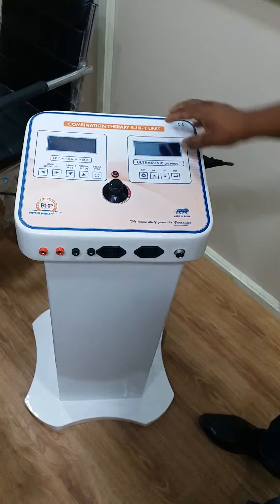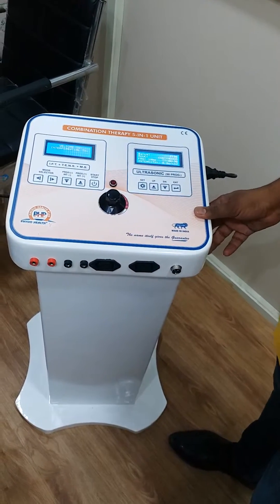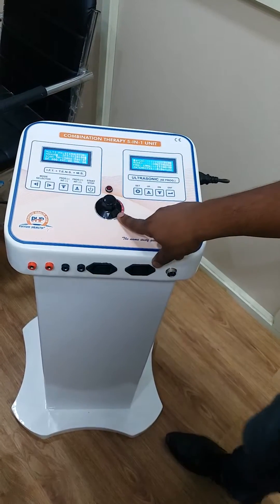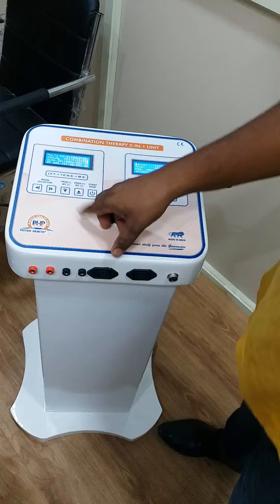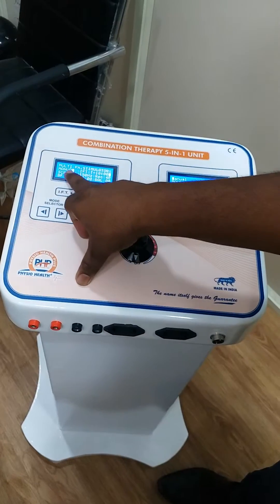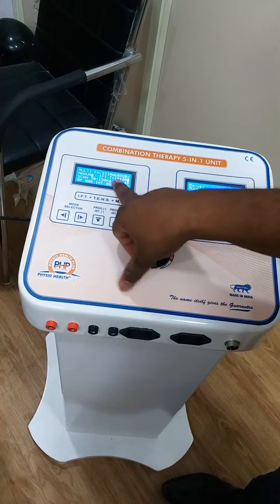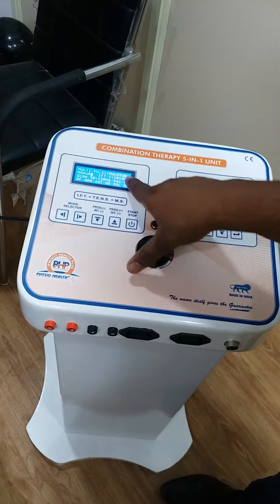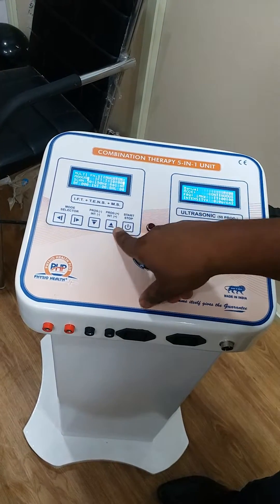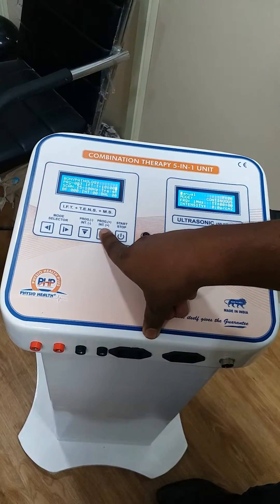This is a five-in-one combi machine. First, here is the IFT, TENS, MS, and Ultrasonic. This is a manual IFT and TENS machine. Firstly, you select the program here — there is program plus and program minus. You can see the program number here: program number one, program number two. Here you change the program.